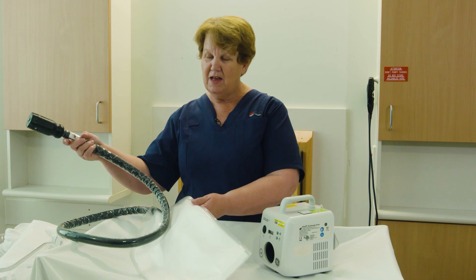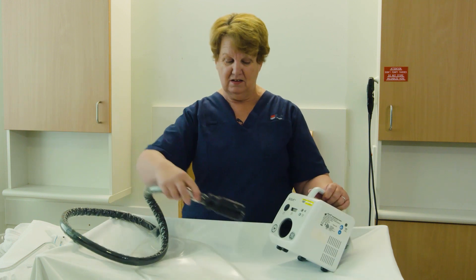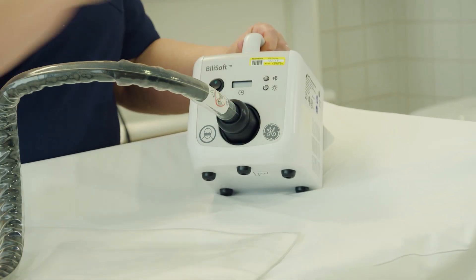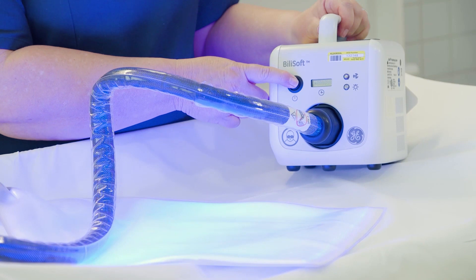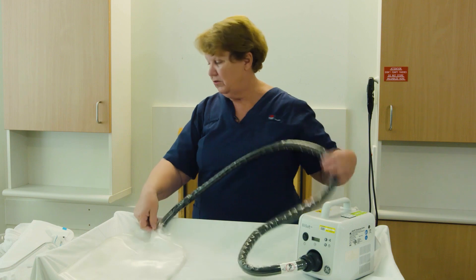The soft pad that the baby is going to lie on connects to the machine at the front with a simple pushing. It is then operated by a simple on-off switch. It is a flexible cord.